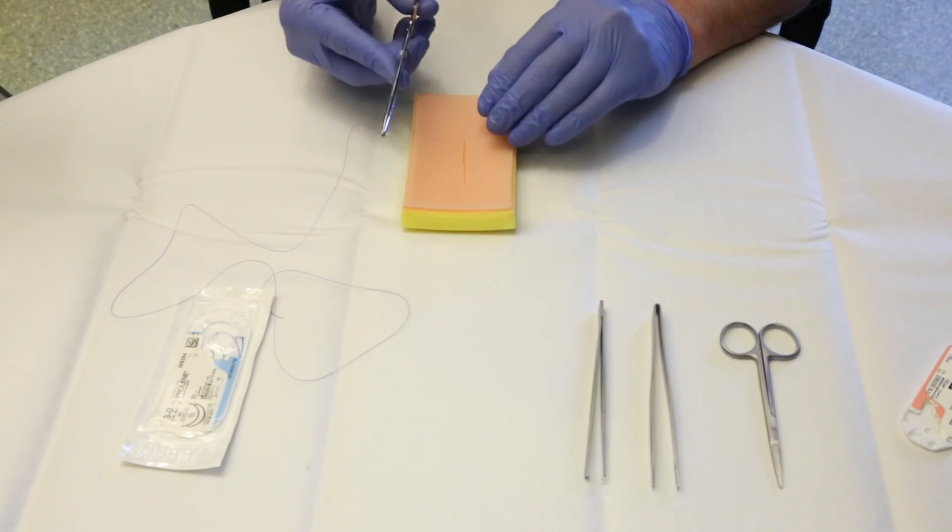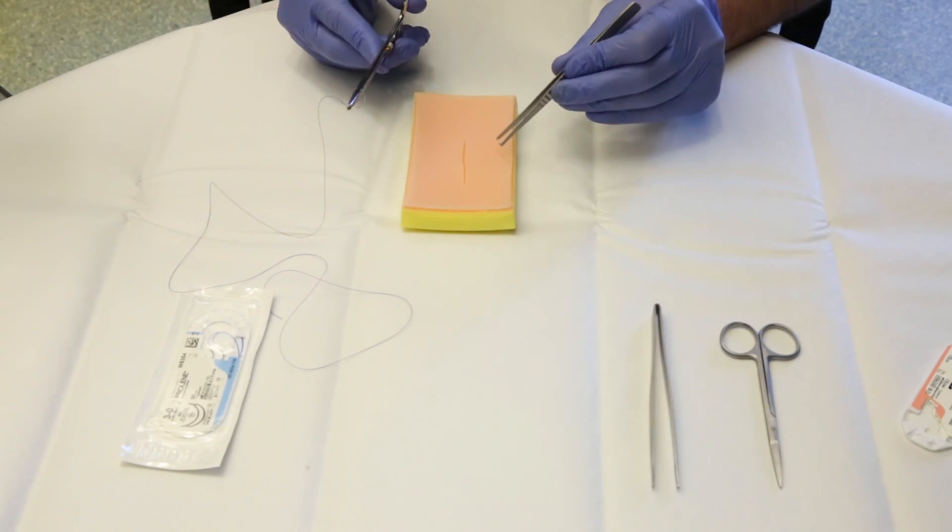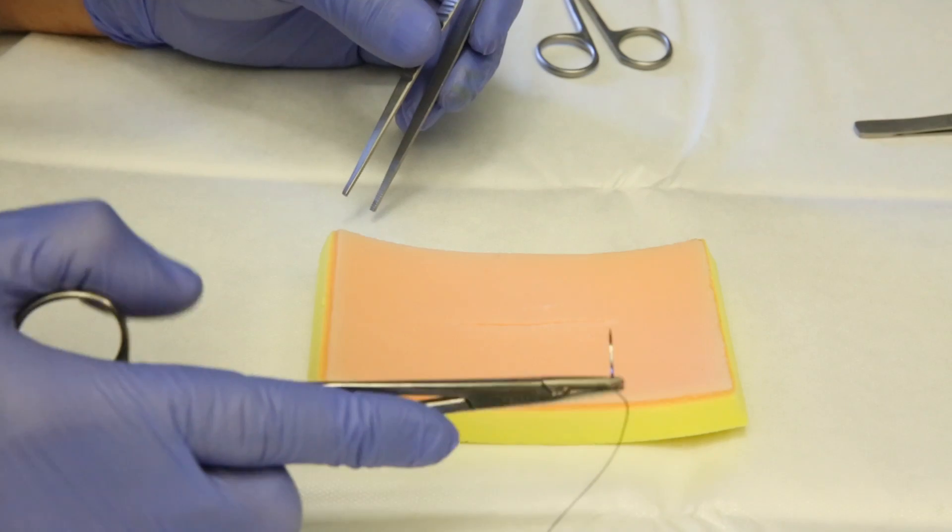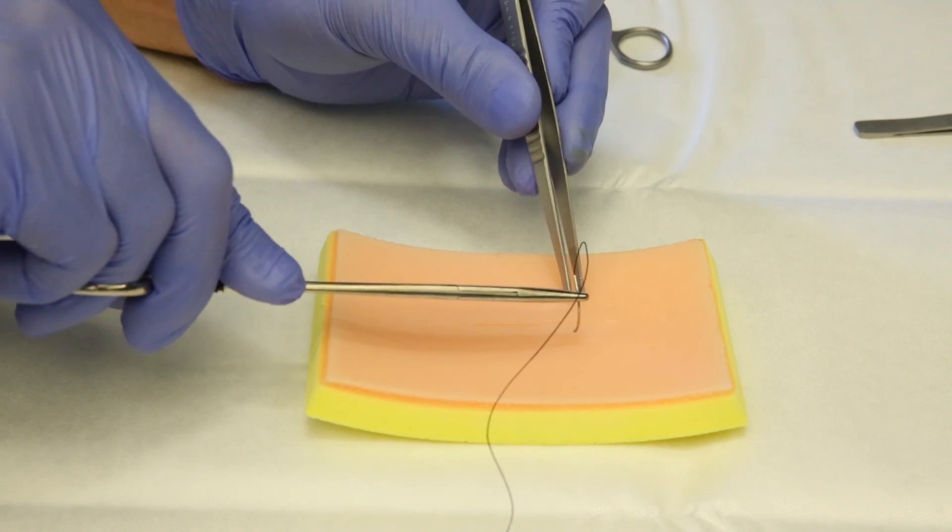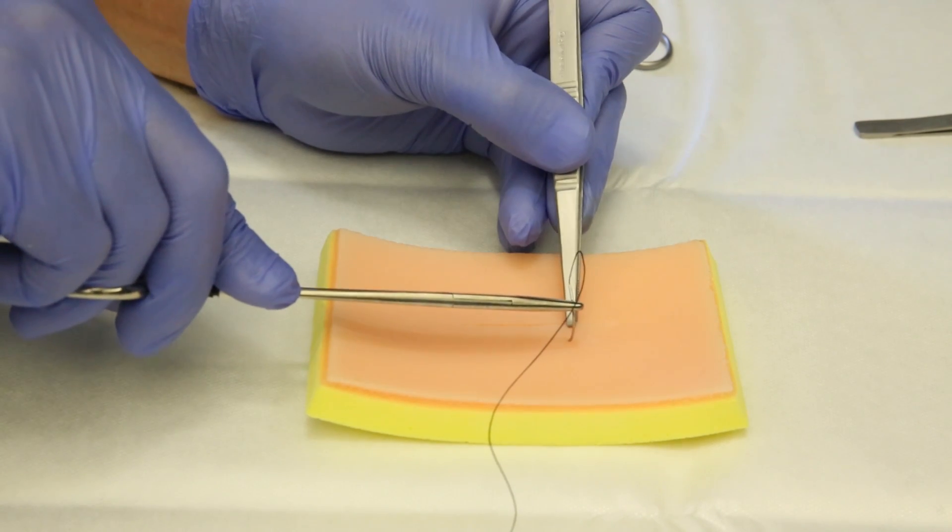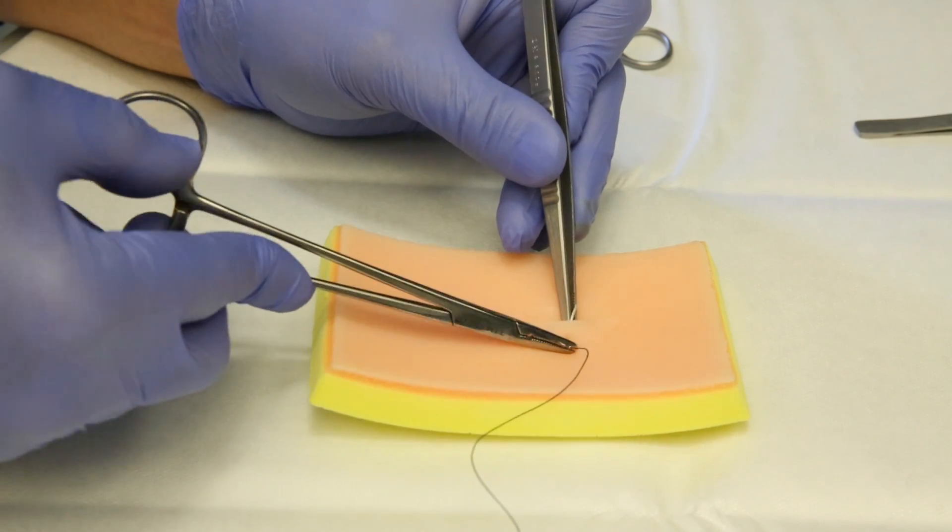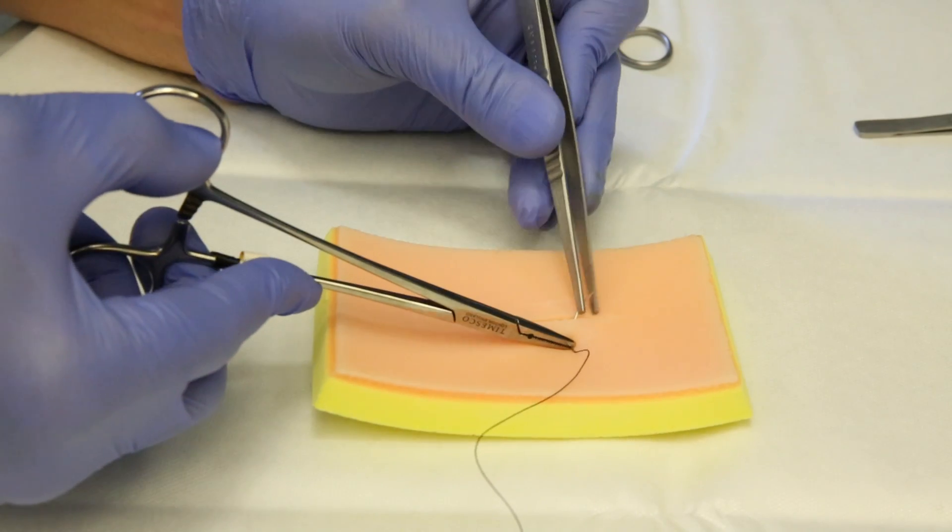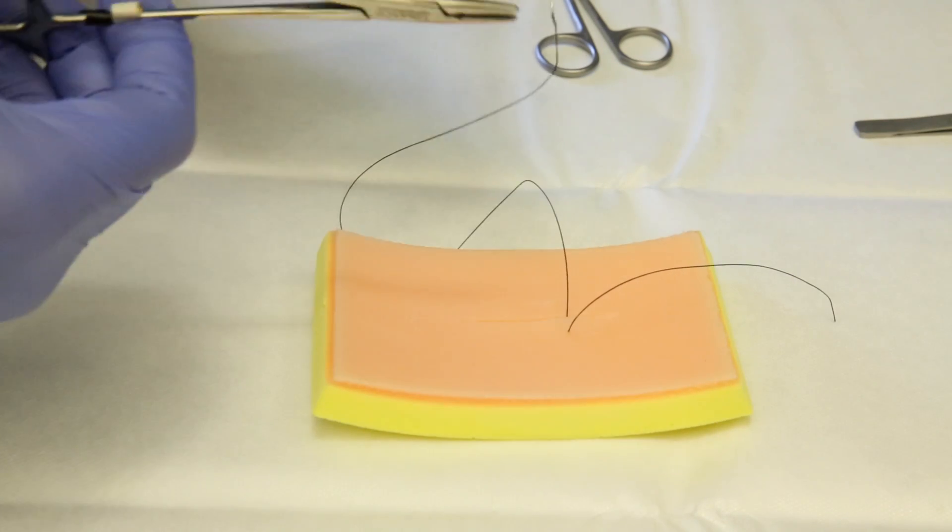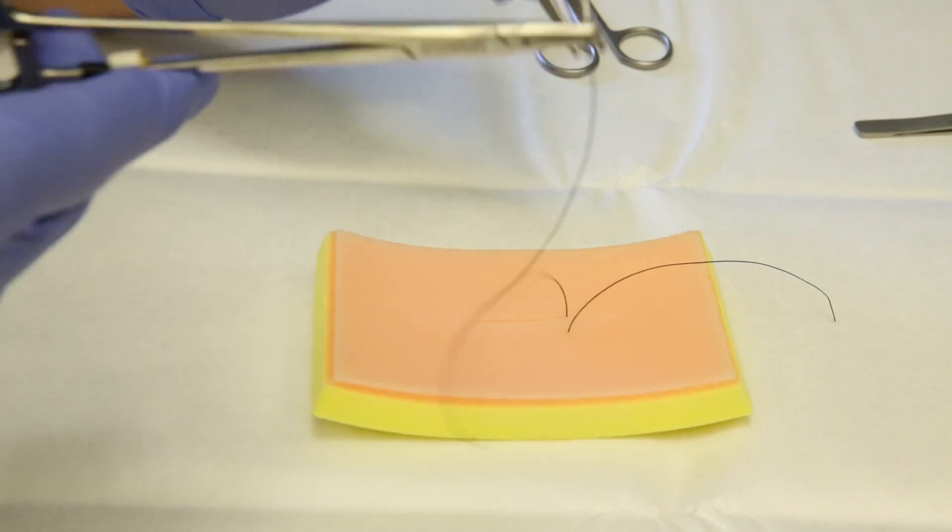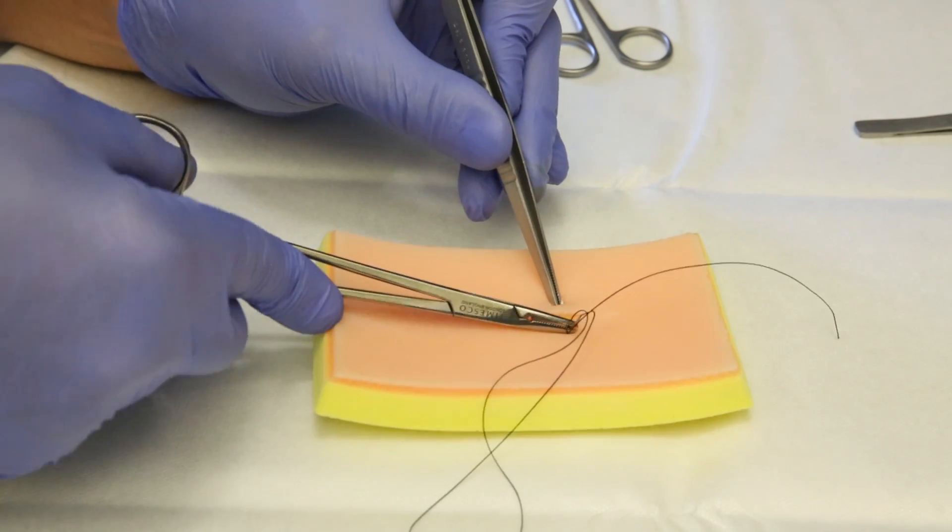Now to start the stitching, the first step is to take the needle across the wound margin. Going perpendicular from the right margin of the wound, through the skin, out through the wound, going back this time from inside the wound and out the skin.